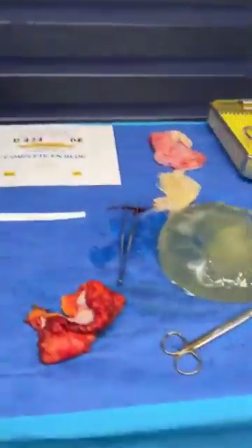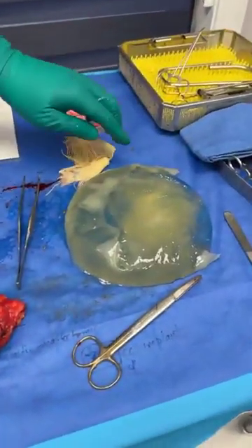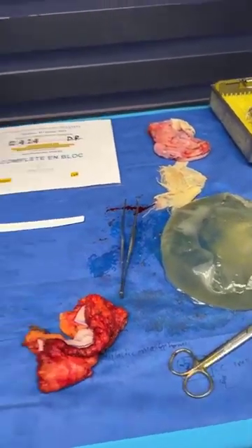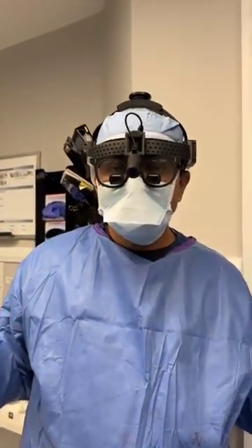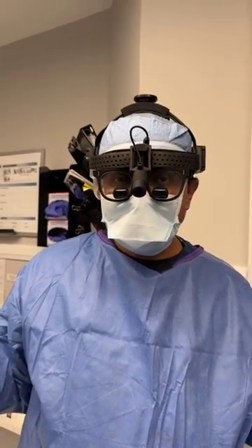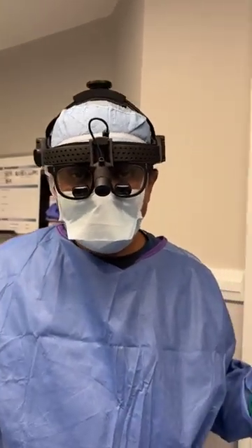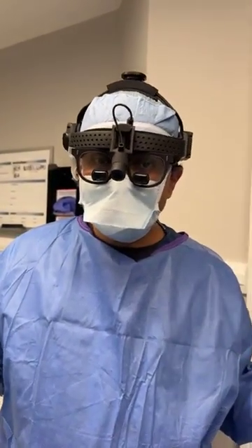I just want to show you one more time. Look at this implant and look at this implant. Look at the shell of the implant, how it's literally disintegrated. It is not gummy bear, and this is the same set of problems that the implants went through in the late 80s and early 90s before they were banned, and I think it would only be more appropriate if that were to happen sooner rather than later, so the ladies don't have to get hurt like this.